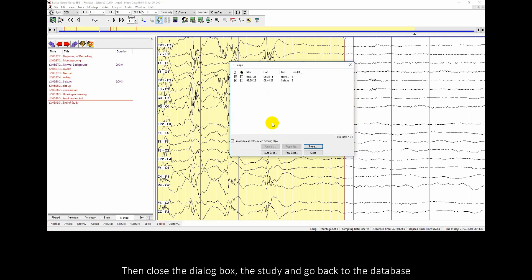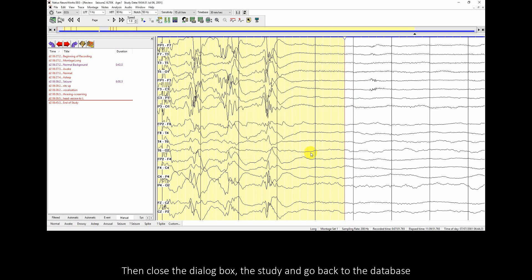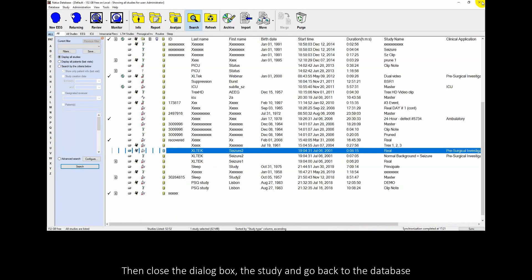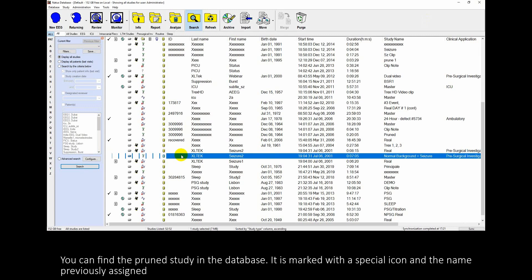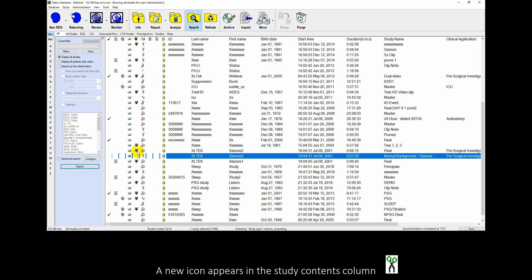Close the dialog box, the study, and go back to the database. You can find the prune study in the database — it is marked with a special icon and the name previously assigned. A new icon appears in the study contents column, and the title is shown as the new study name.